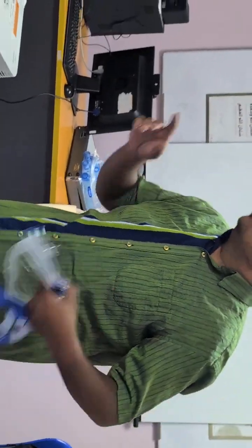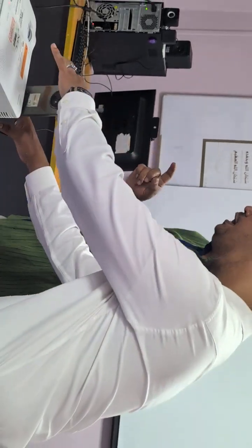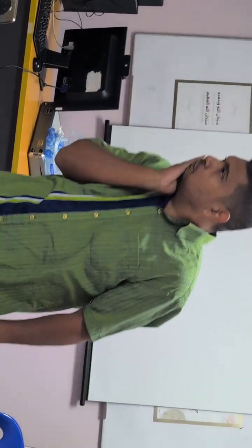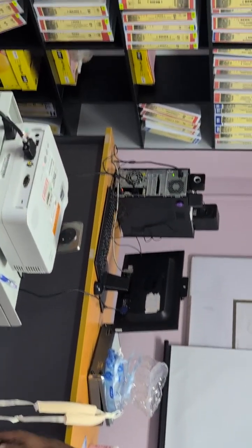Doctor, next week I'm actually coming back here for another CME. I'm not sure when. On the ED department. So when I am coming, I will bring it over. For that, I need to confirm whether my ventilator can handle it. What ventilator are you using? You're using C1. C1 there, C3 there, T1 also there? E1 there. All three can? Yeah.